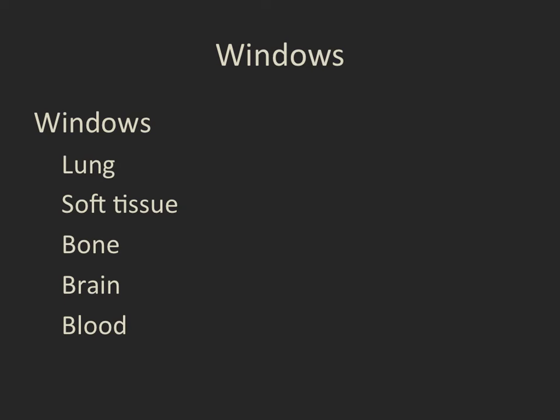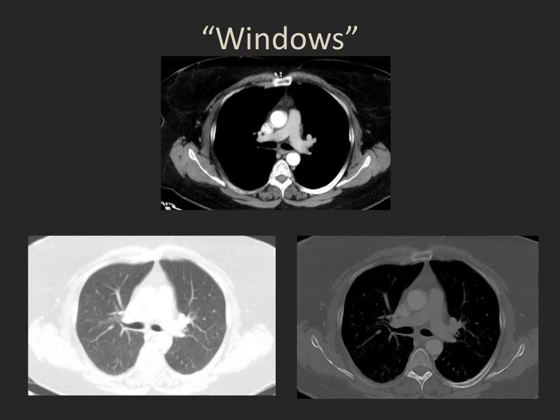Windows do not require reprocessing of the primary data, but instead are different ways of displaying the information that is on the image. Each of these different windows aims to maximize the display of one particular set of soft tissues, but at the cost of not seeing the others. For example, here we are looking at soft tissues of the mediastinum, but we cannot see the lung. We can see the lung on the lung window, but we can't see the mediastinum.